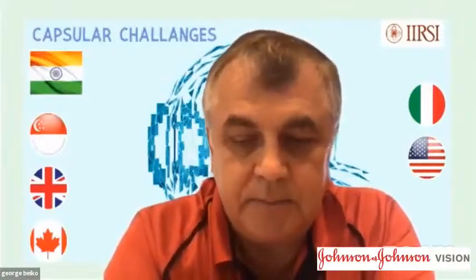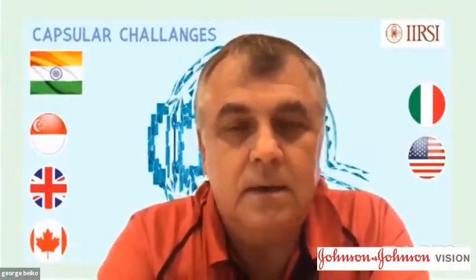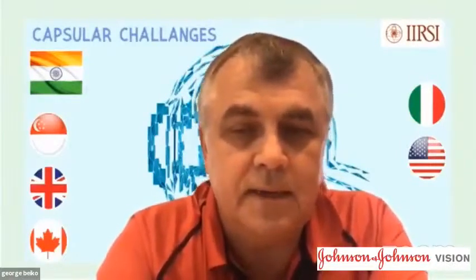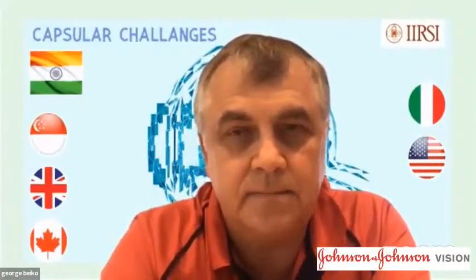I think the problem in Canada is that most of the plate haptic lenses are hydrophilic in nature. You always have to consider that if you put that in and the patient ends up having a retinal detachment and gas being used, that hydrophilic lens may opacify. So that always has to be in the back of your mind with a PCR and a hydrophilic lens. Thanks, George.